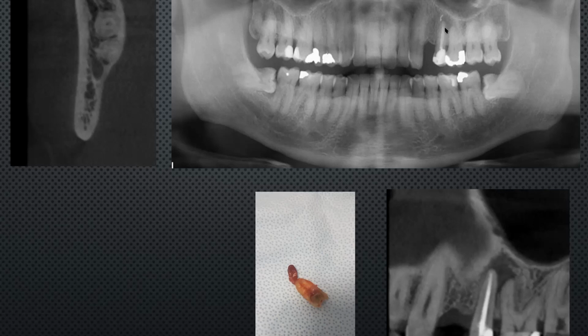And particularly if patients are asleep, I can't just walk away and go, well, I'll just wait for it to heal and come back. I have to finish the operation somehow. It's important to have those skills, absolutely, but perhaps not when you're starting off. But I would highly recommend that you use it as an opportunity to think and to learn, and not as, this is great because it means I don't have to think while I'm placing an implant. It's a slam dunk and it's easy.